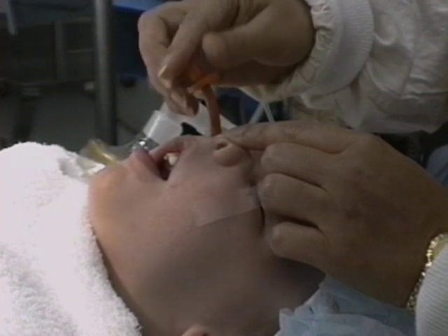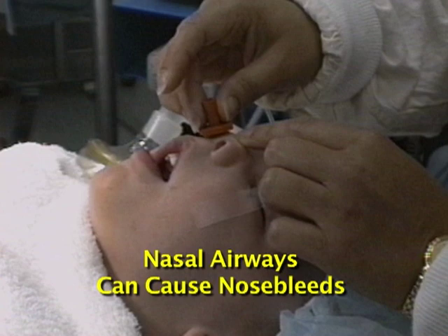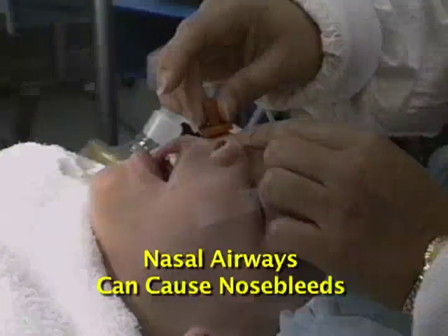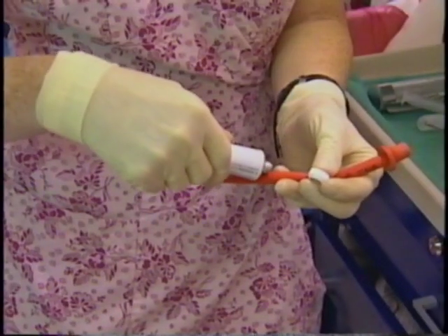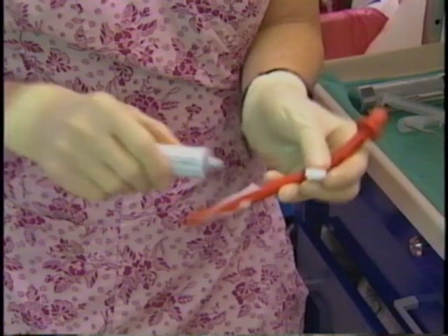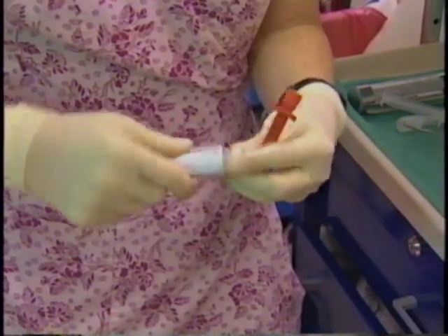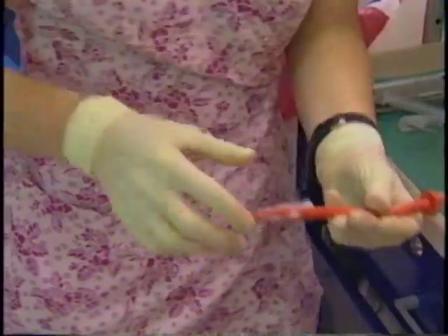However, it must be used with caution in pediatric patients. Nasal airways can cause nosebleeds, especially in 3 to 6-year-old children with hypertrophied adenoids. Always lubricate it well with a water-soluble gel. A local anesthetic gel is best because it also numbs the nasal passages. Avoid plugging the tube with gel.